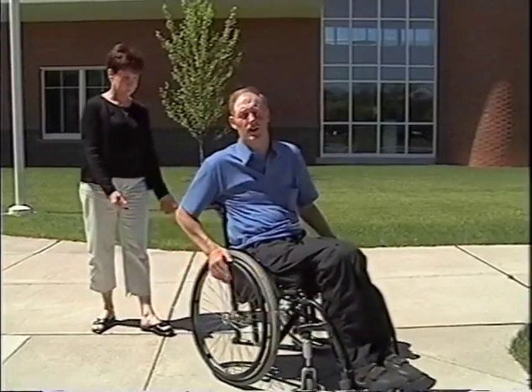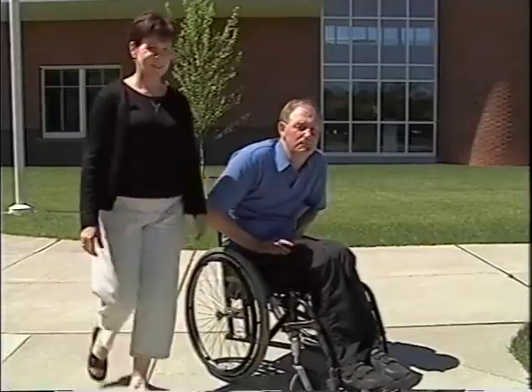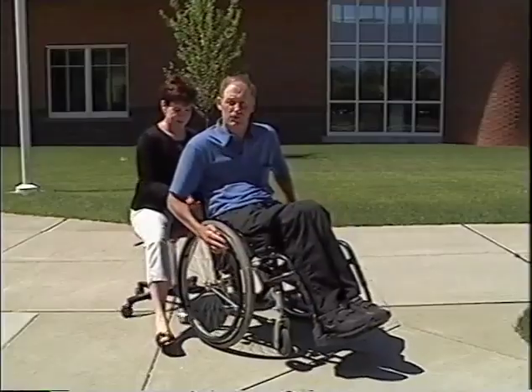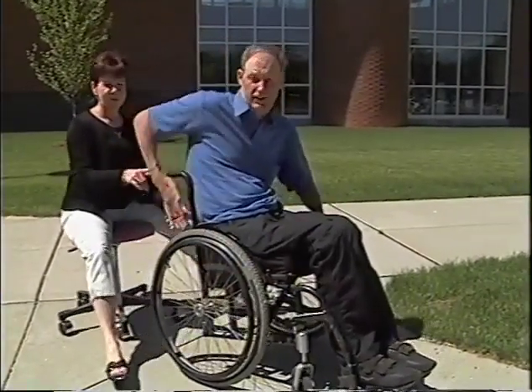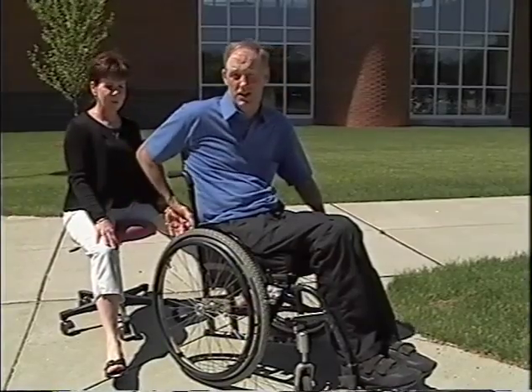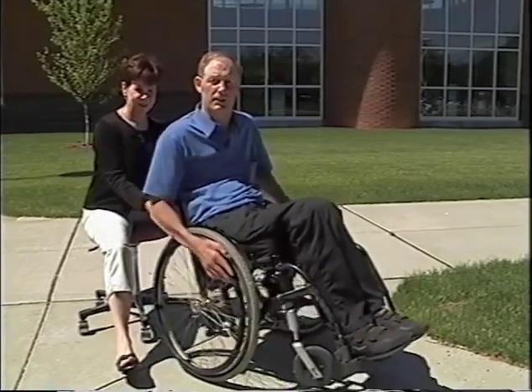And if you're a teacher of this and you're going to be doing this for half an hour or so, could you grab that bench, Meg? One way to spot is to have a bench with little wheels behind you so that you can practice wheeling and stay right behind. A lot of today's chairs don't have the canes on the back. They simply have a metal bar across down here. So you'll end up with a sore back if you're a therapist trying to spot somebody for half an hour. So this is a real back saver, a little trick that you can throw in your toolbox for the future.